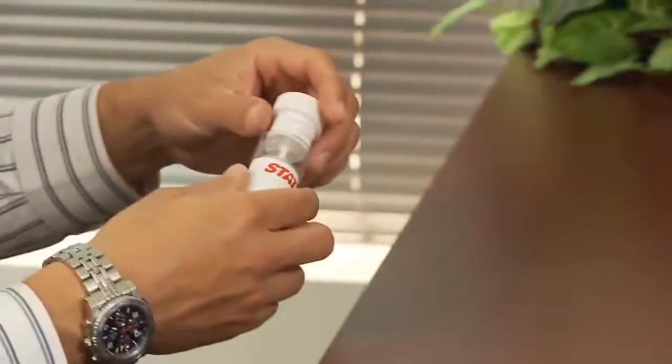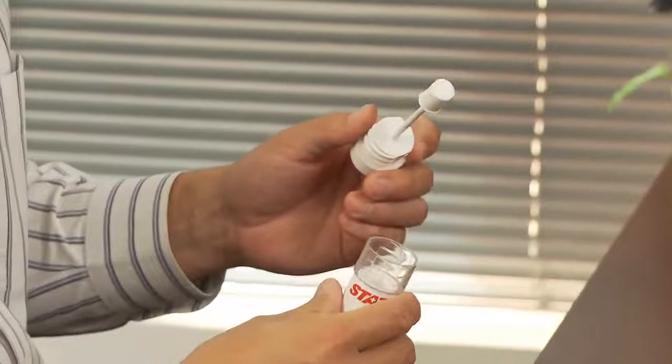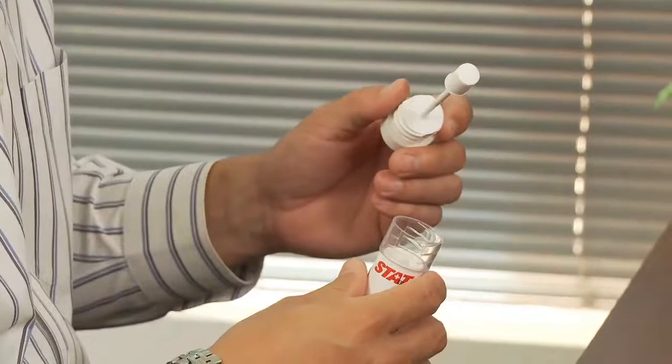Have the donor remove the collector cap and sponge from the collection chamber. The sponge will be hard initially but will soften as it absorbs the saliva.